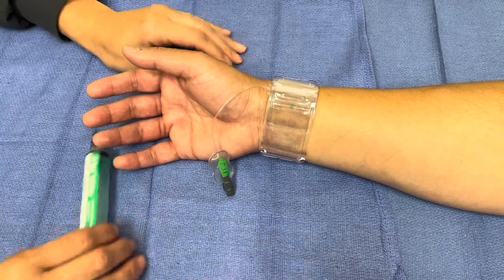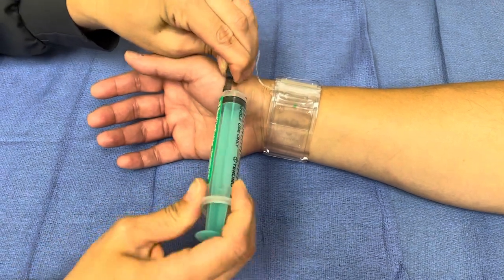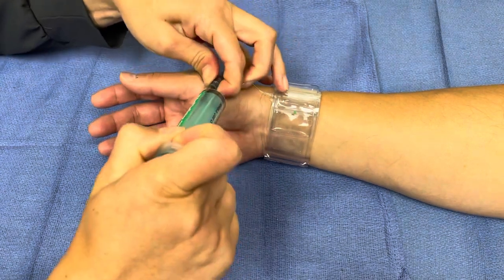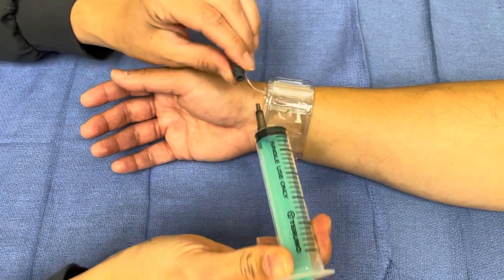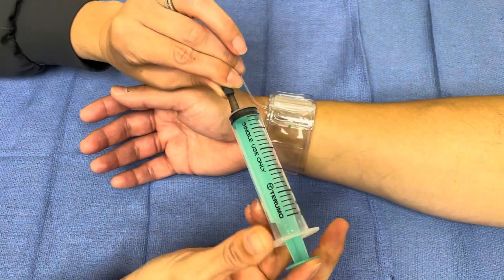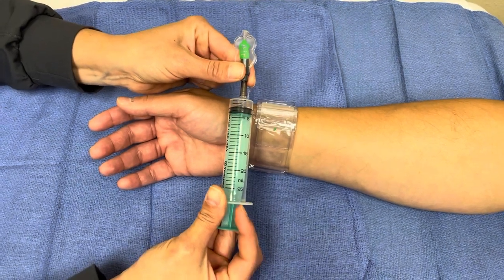Next, we're going to be careful that when we apply the syringe, if we have air in the band, we're going to be really careful that we don't just let all the air out. We have to make sure that when we attach the syringe, we've got back pressure on the band. Then when we start taking air out, we're going to take two to three cc's of air out at a time only.